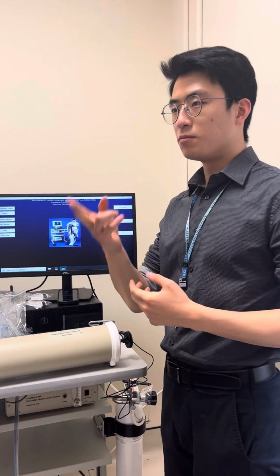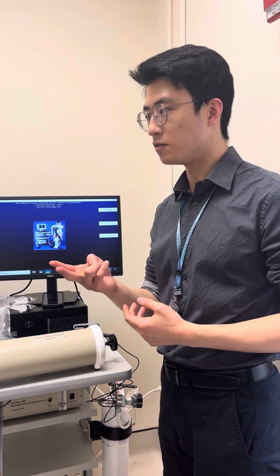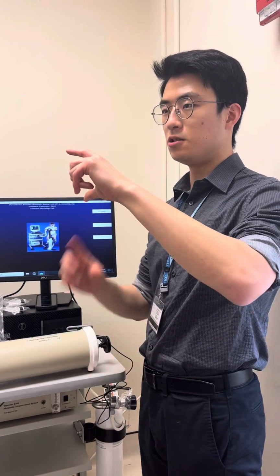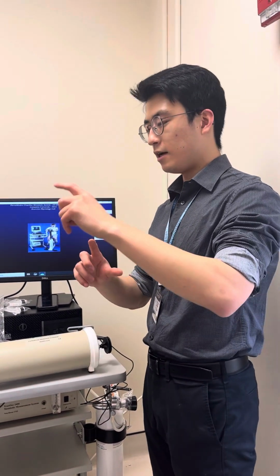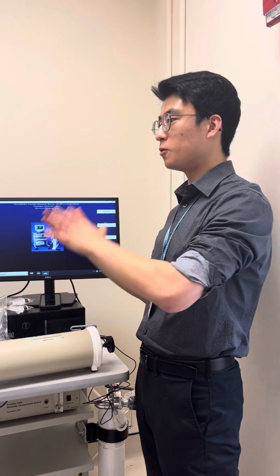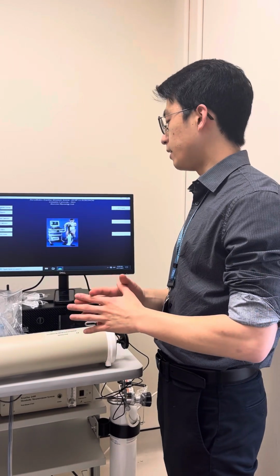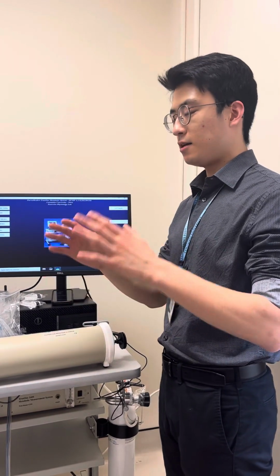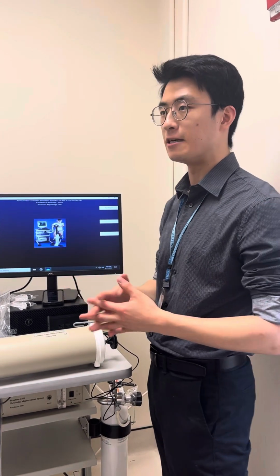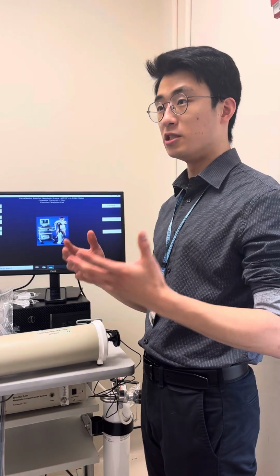The second thing that's very important to understand about CPET is the respiratory exchange ratio, RER. So that is the ratio of VCO2 to VO2. And the respiratory exchange ratio is also known as the respiratory quotient in different subfields. It's basically, at rest, this respiratory quotient is an indication of metabolic state. And it typically depends on, among other things, your diet.